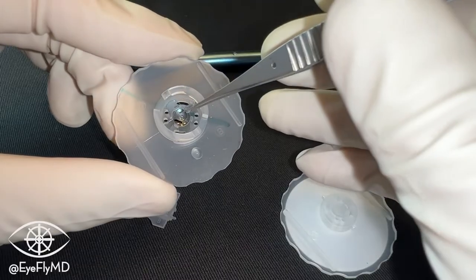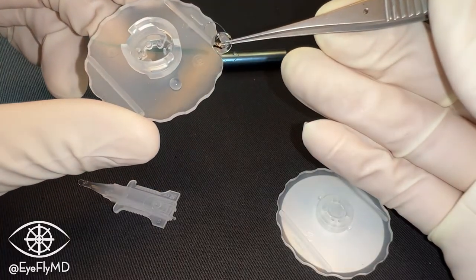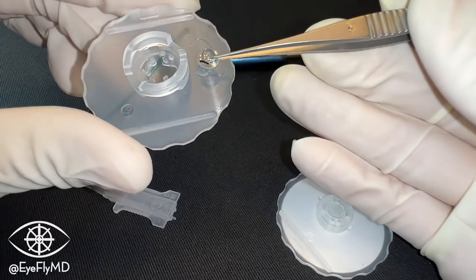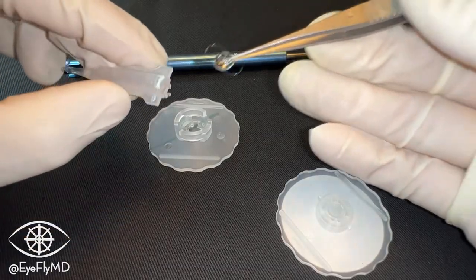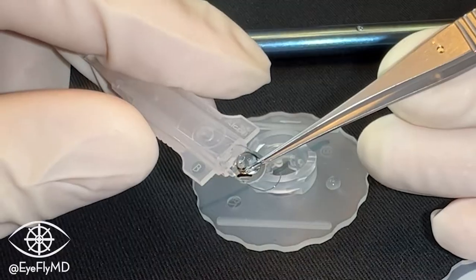This time, we're going to take our non-toothed forceps and very carefully lift the IOL by the optic. We really want to avoid touching the haptics — they're usually made out of PMMA and very fragile. We're going to dip the other side of that optic in the OVD just like last time, then insert the IOL, checking orientation again, into the cartridge.